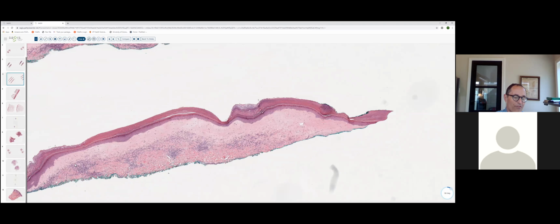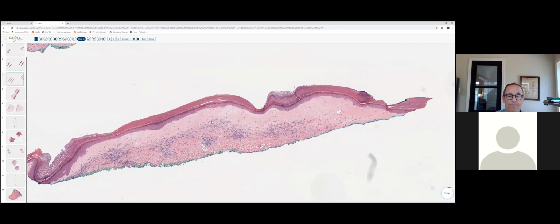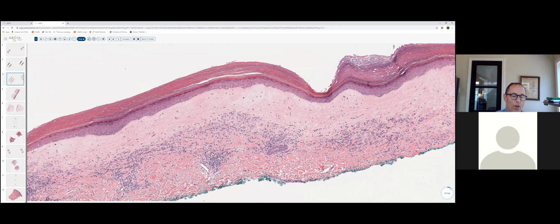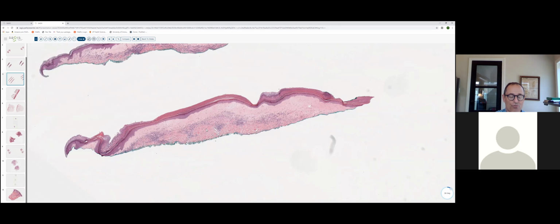So it's going to be basophilic or elastotic, usually due to a combination of sun damage and the radiation itself. Two, you tend to get very ectatic, widely dilated vessels within the papillary dermis in radiation dermatitis, which we don't see here. Three, you tend to get the radiation fibroblast, plump stellate fibroblasts within the papillary dermis, which we don't have here. And lastly, you tend to get adnexal destruction with radiation.